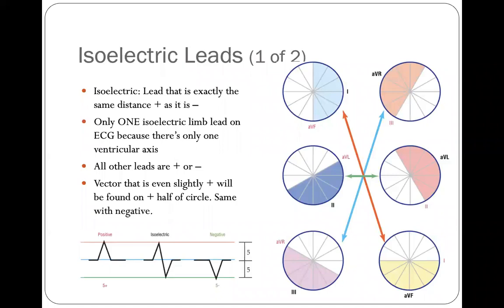This is a cartoon that I've shown you in the past, but this shows you where the leads physically are on the EKG. We're obviously not looking at the precordial leads, so V1, V2, V3, V4, V5, V6 are not here, but you do see the lineup that we have here. This is lead 1, here's lead 2, here's lead 3. This is AVR, AVL, and AVF.